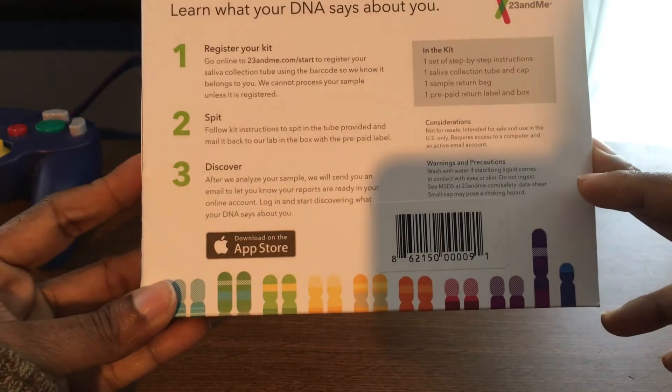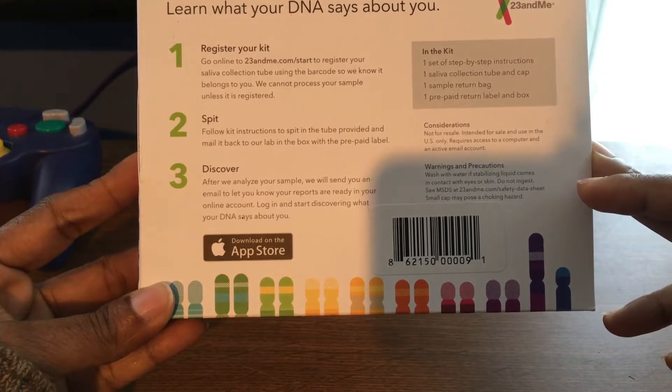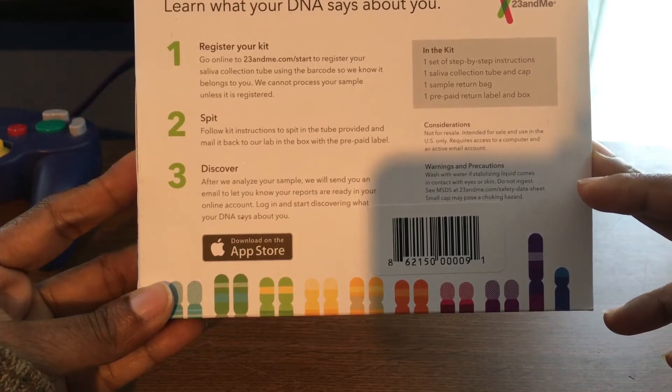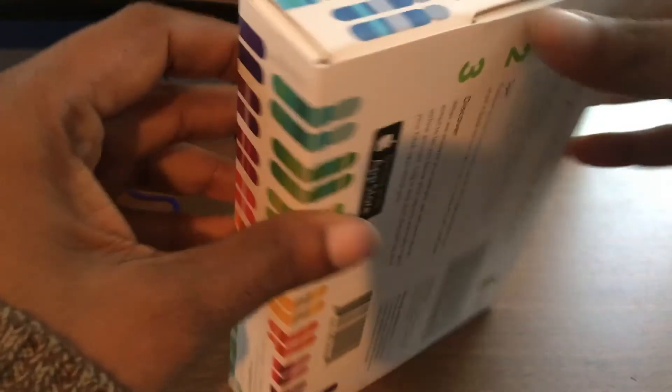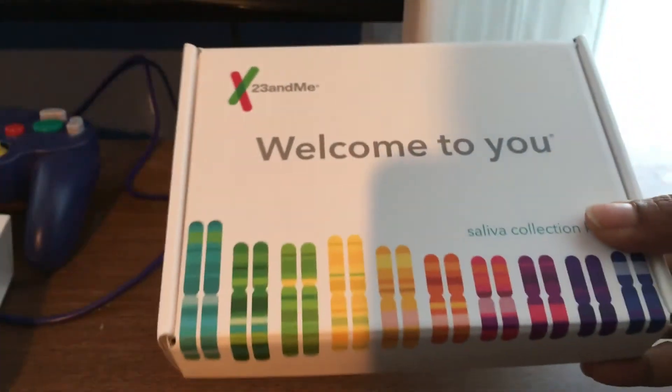The kit includes one set of step-by-step instructions, one saliva collection tube and cap, one sample return bag, and one prepaid return label and box. Let's open it up and see the inside.